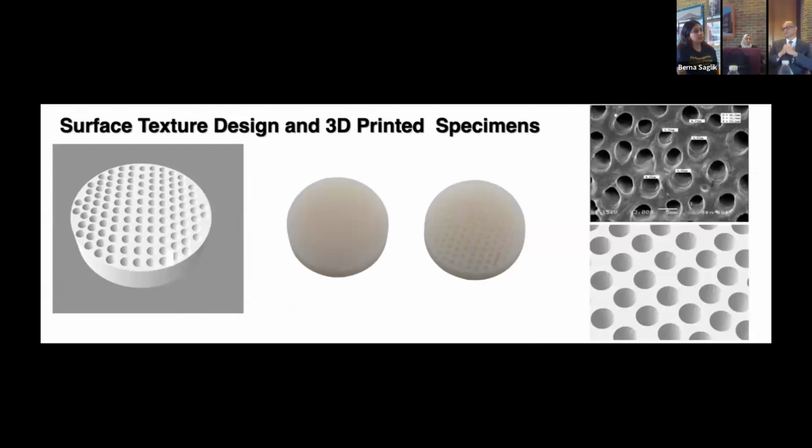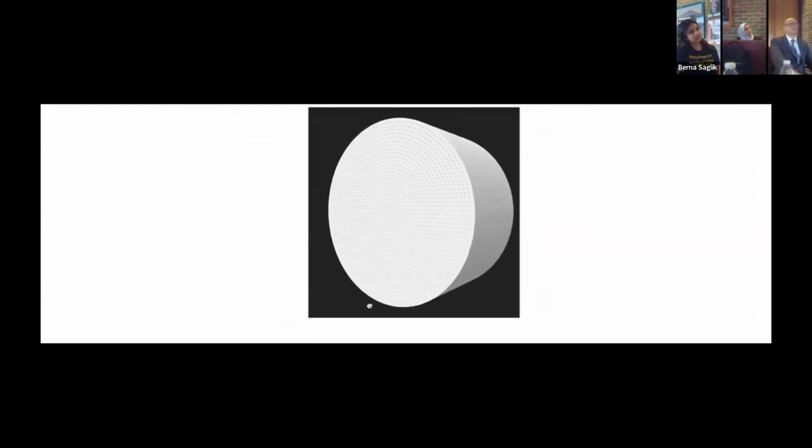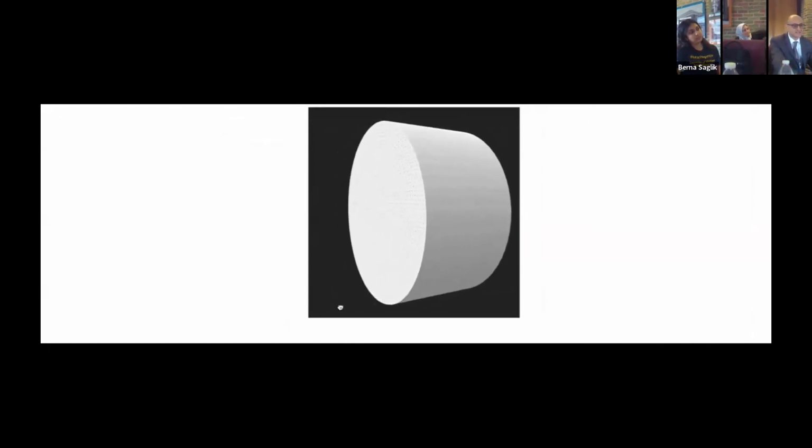But what is fascinating, going back to that vision of 3D printing, is what we can do. You can customize your surface. I was fascinated with that research, where they did lots of roughness on it. We started with porosity, and my concept was that I need something like the etch enamel pattern or the etch dentin pattern. As you can see on the top right, it's a dentin, clean dentin side with the tubules, and down below is a 3D print that mimics that. So my concept was that if you do that, you should be able to get a good bonding factor through the tags you created. So we started that with some resin 3D printing, and then we did ceramic 3D printing as well. On that, we could create different porosity sizes with different distances between them.